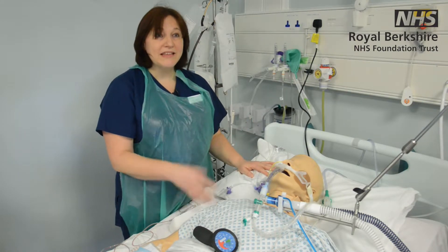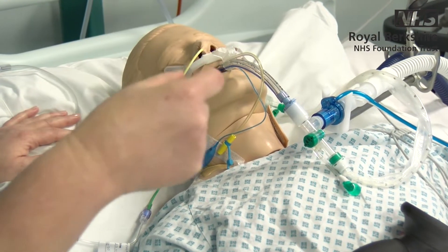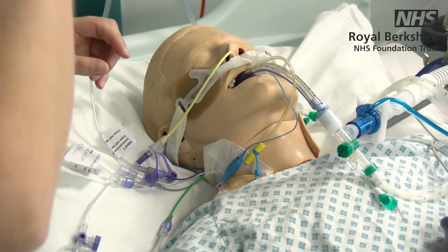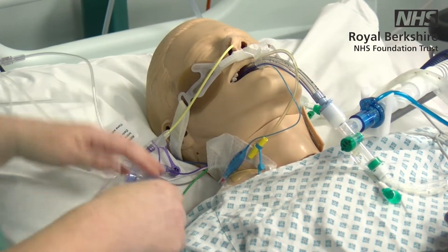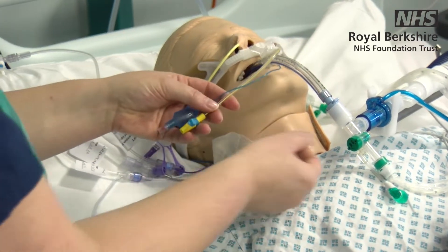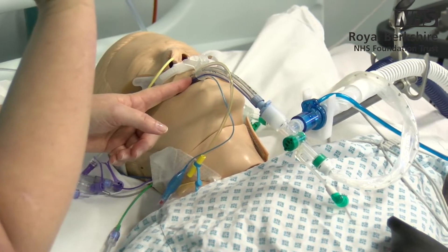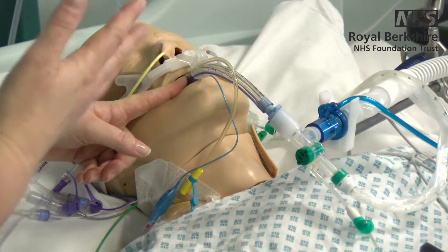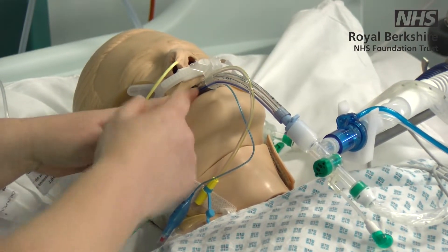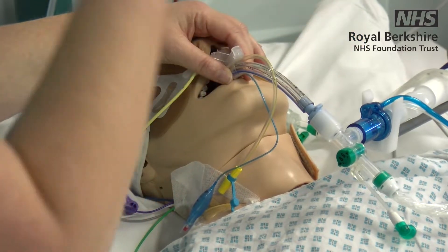The most important thing is the ETT — the endotracheal tube. A later clip will go through exactly where the tube sits anatomically and what we're doing in terms of ventilating the patient. You'll see it's a tube set at a certain level at the teeth, and in most adults — certainly for a man — it will be about 22 centimetres. The aim is for that tube not to move in or out.